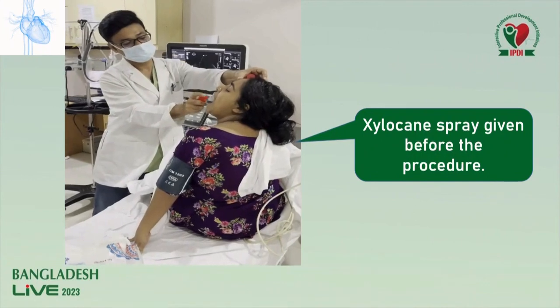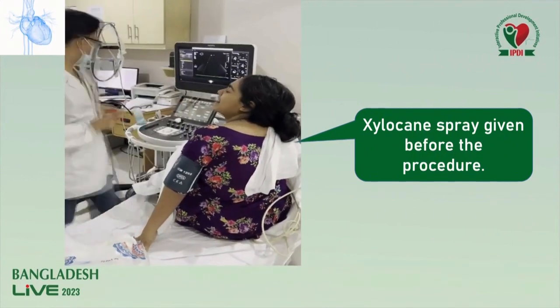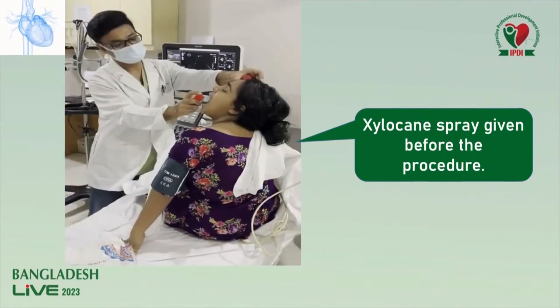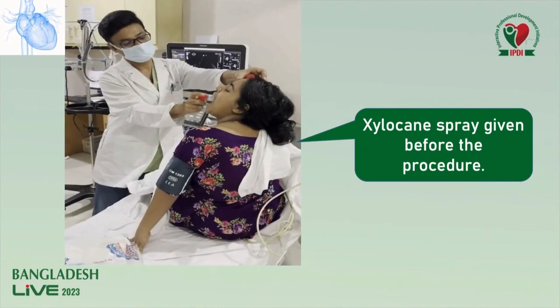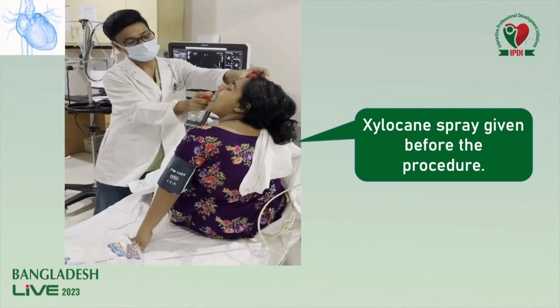Xylocaine spray is given before the procedure. Four to five puffs is sufficient for local anesthesia.